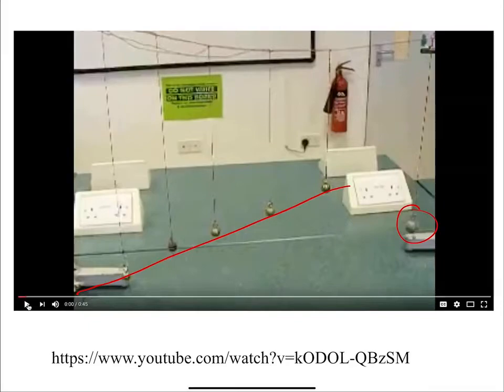Instead of a gradient with lengths of string, we have a gradient applied with our magnetic field gradient, okay? Such that depending on where you are, you have different resonant frequencies. And so when we come along with a driving frequency that has one resonant frequency, it's going to mostly drive the spins at that resonant frequency, and it's not going to be as effective at exciting the other spins. So that's the basic idea.